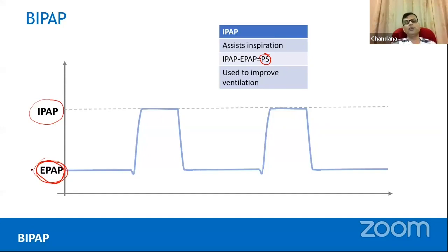So whenever you need to increase oxygen, you can increase the FiO2, the fraction of inspired oxygen we can give, but at the same time, increasing oxygen is just a temporary measure. It won't help any underlying condition. So remember that one, oxygen will not cure any underlying problem. It is just to increase FiO2, but the EPAP or the CPAP will recruit more alveoli, will open up these collapsed alveoli, will increase the lung volume, and it will help to sort out some of the underlying issues.